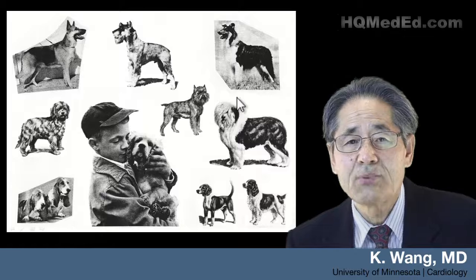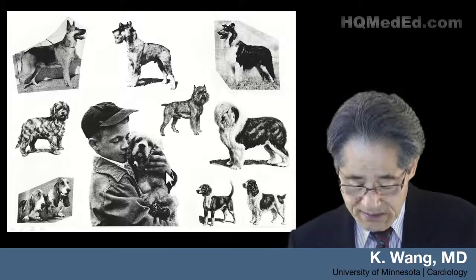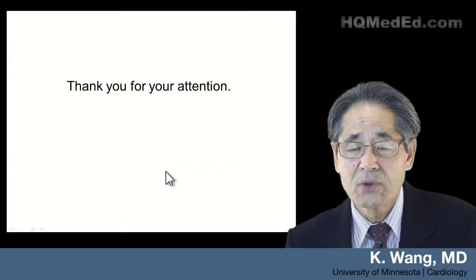Just as there are many breeds of dogs, there are many causes of ST elevation. Thank you for your attention.